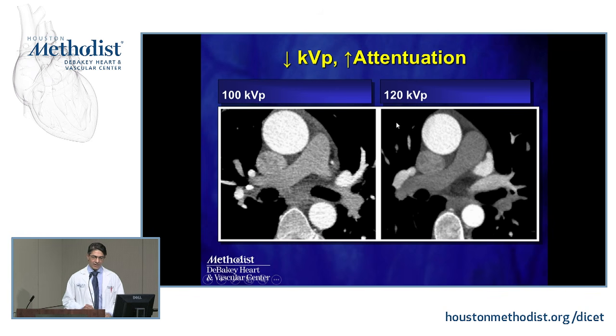So you'll see there's a lot of emphasis sometimes in our lab where we try our best to figure out the size of the patient, whether we can get away with low kVp. Because low kVp not only means less radiation to the patient, fewer higher energy photons going through that patient, but it also means that we actually get a better interaction with the iodine, and we may get a brighter picture of those vascular structures.